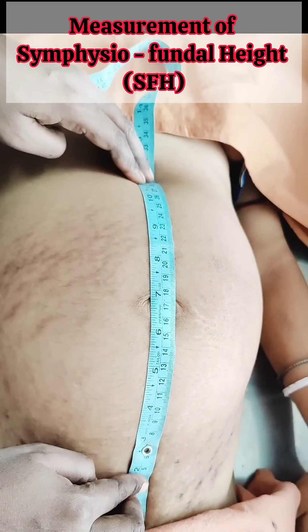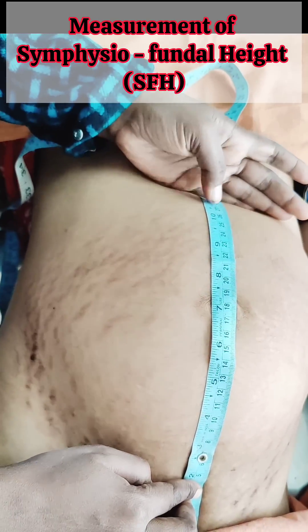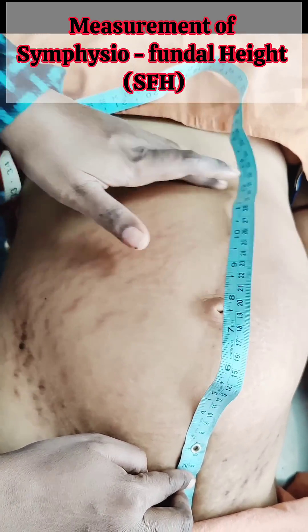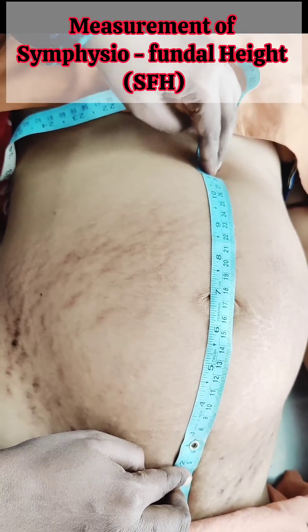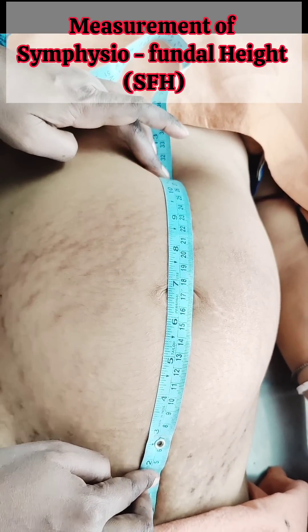Hello everybody, today we will demonstrate the measurement of symphysiofundal height with a measuring tape. Symphysiofundal height is the distance between the upper border of symphysis pubis to the highest level of fundus, as detected by the ulnar border of the left hand.